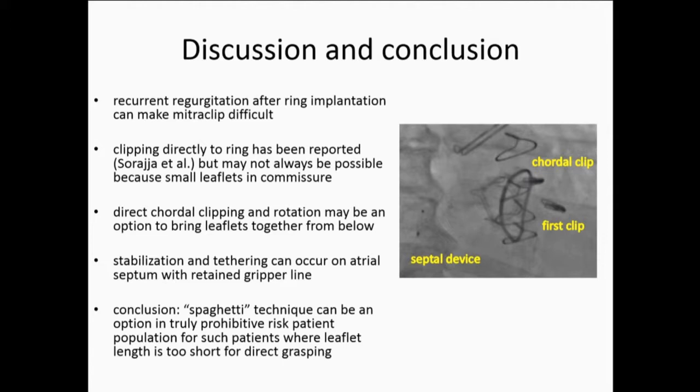I think that I probably would have, if it wasn't an easy thing to do, told Colin Barker, my guy that does the transseptal valve-in-ring, let's just stop and move to the transseptal valve-in-ring. This is a very favorable ring to do this in. It's not a hard thing to do. He hasn't had a previous transseptal procedure. He's probably got a big atrium because he's had AFib before. He had a maze done. He's probably got plenty of room working for him.